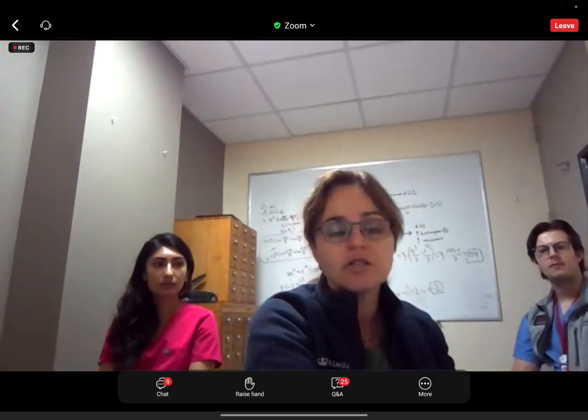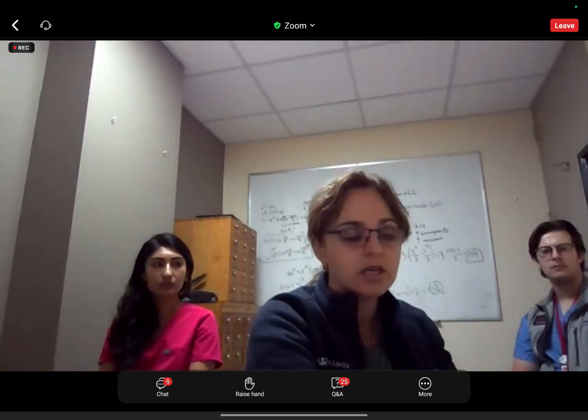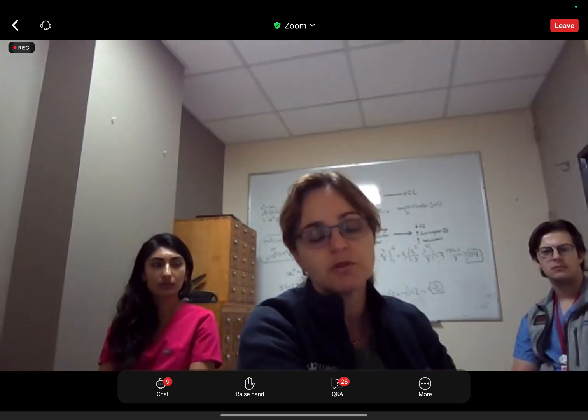Phenomenal question, and I think we have enough data and expert consensus to say that in lesions which are hyperintense on pre-contrast, to confirm arterial phase hyperenhancement, you want to use subtraction. You also often cannot assess viability without subtraction when you have a lot of T1 hyperintensity. All that being said, subtractions are tricky because you want to make sure that the registration is correct, and in most places, the radiologist has no control, you cannot manually realign the images. For example, we have a program where you can do that. So if you can do that, that becomes more reliable. You can actually readjust.